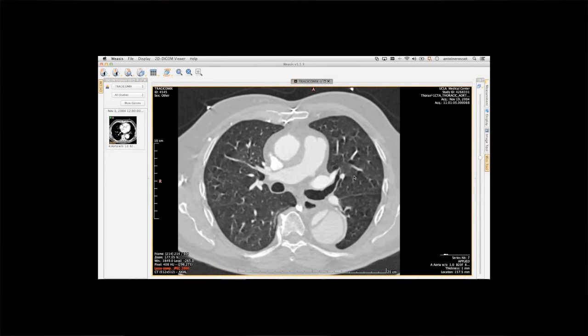So what happens is the sugar molecule will get trapped inside of the tumor along with this little radioactive tracer that we have. So you end up with, if you do have any tumors anywhere, this radioactive stuff, and then the PET scanner waits and looks for the emission from those areas and reconstructs it, and then you get an image of where you have the most metabolic activity.